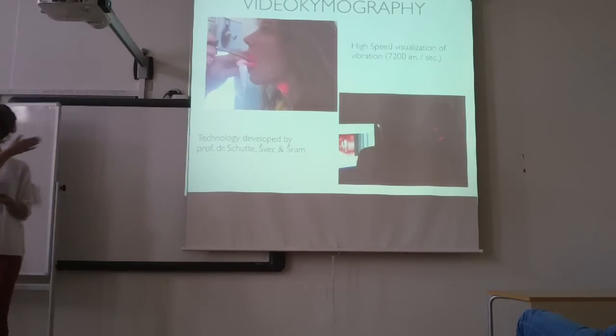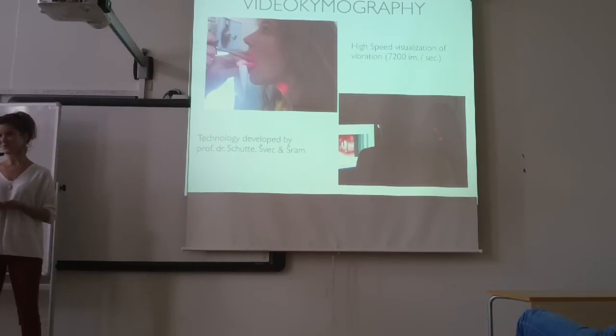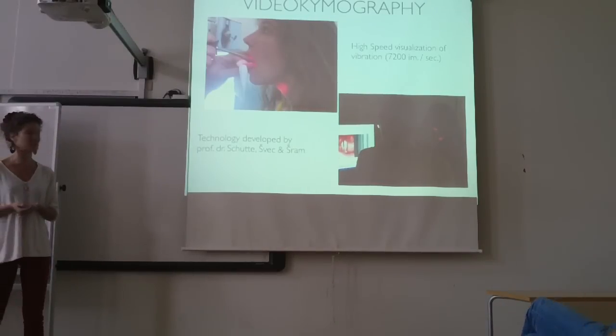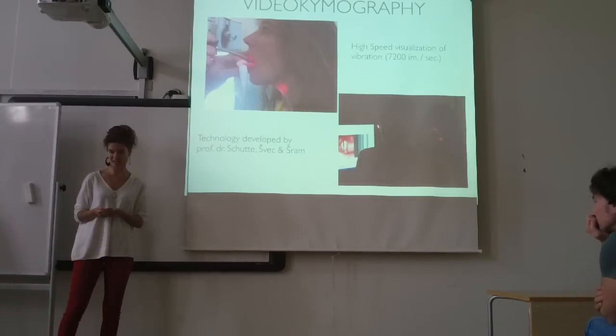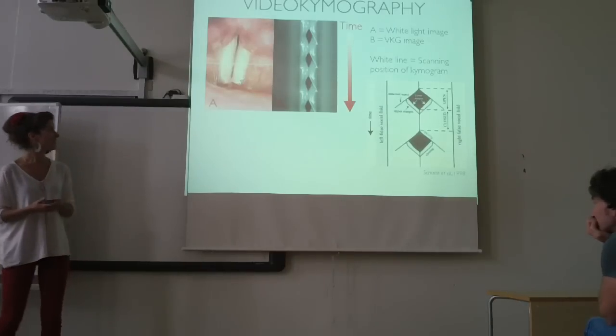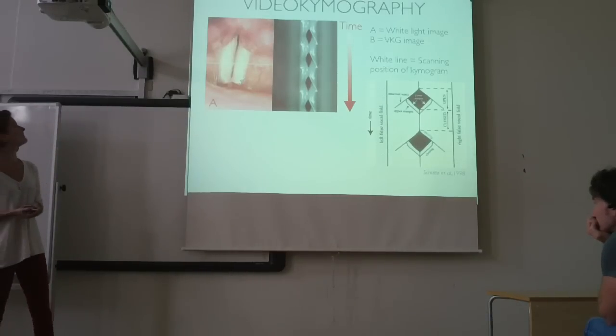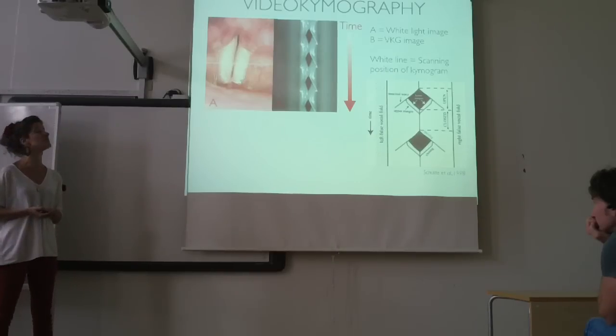What is videokymography? As you can see, the tongue is being pulled out quite a lot. It's a high-speed visualization of the vibration up to 7,200 images per second, and the technology has been developed by Professor Dr. Svetch and Schramm. Difficult name.